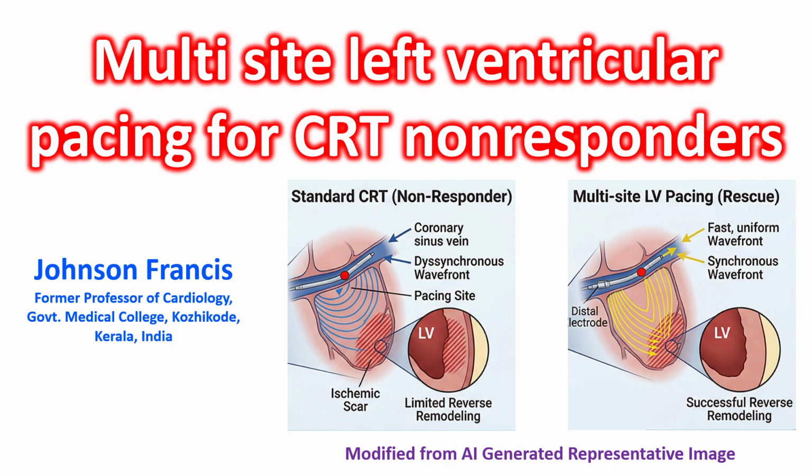Multi-site left ventricular pacing is an advanced evolution of cardiac resynchronization therapy. While standard cardiac resynchronization therapy uses a single lead in a tributary of the coronary sinus to pace the left ventricle, multi-site pacing involves stimulating the left ventricle from two or more distinct locations. The goal is to achieve more near simultaneous depolarization of the left ventricle, especially in patients who have large areas of scar tissue or slowed conduction, that is fragmented QRS.